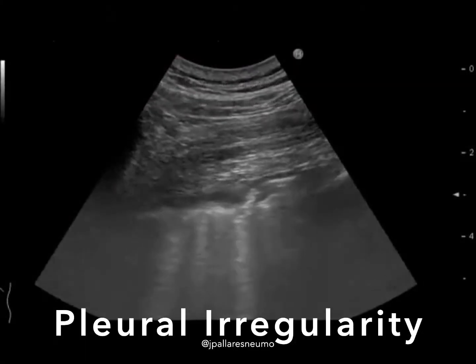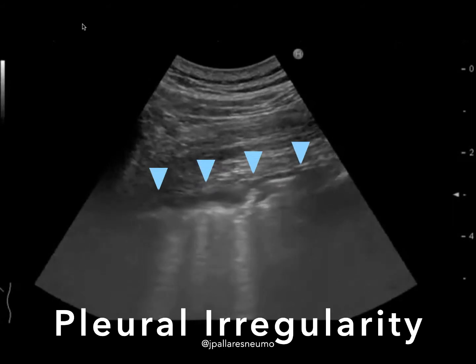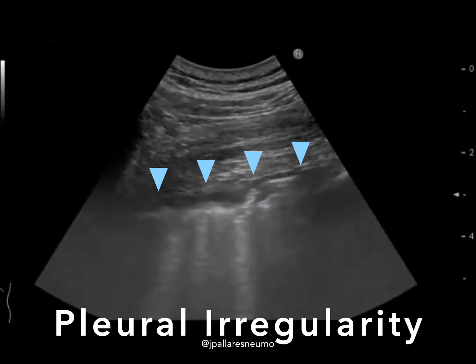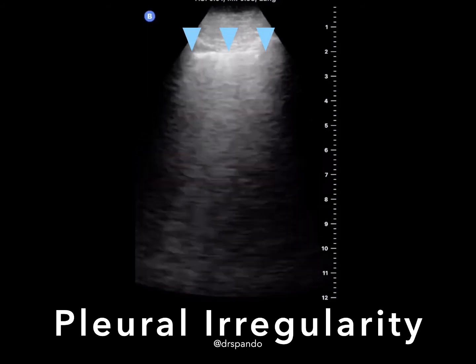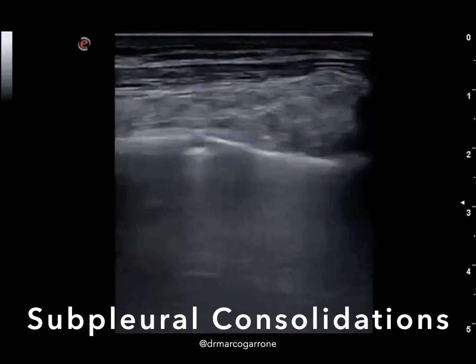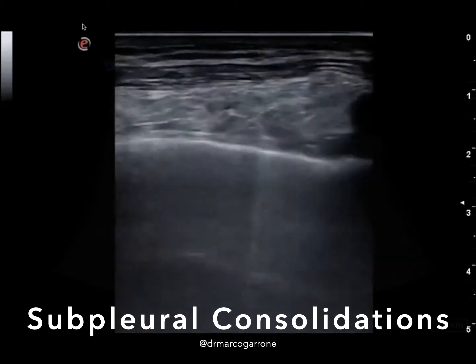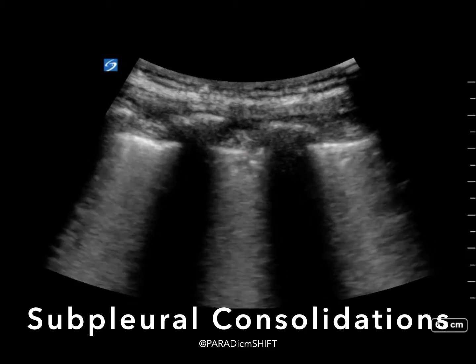Lung ultrasound findings that have been described thus far include abnormalities of the pleura. Patients can get irregularity of the pleural line, as this example demonstrates, or thickening of the pleural line. Here's another clip of pleural irregularity and thickening. Other pleural-based abnormalities include the development of subpleural consolidations, like this example highlighted in orange. Or in this example of a slightly larger subpleural consolidation.